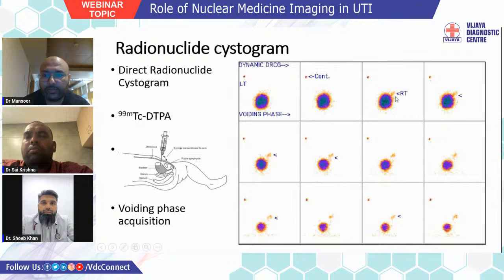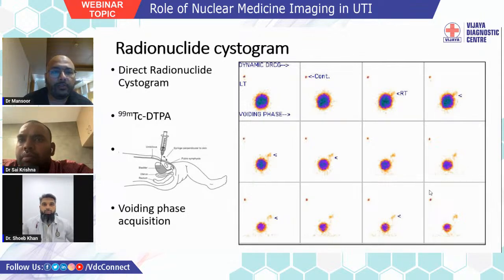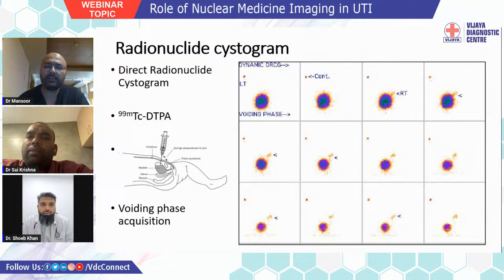Since this is a posterior image, this is reflux into the right ureter. As the patient is voiding, we can see the reflux going all the way up to the pelvicalyceal system. So this is high-grade reflux in the right kidney. This imaging gives very low radiation to the bladder, and especially in a female patient, to the ovaries, we get very little radiation. Of course the injection will be painful, but only for a very short duration of time. There is no risk of ascending infection, as we are not using any catheter.